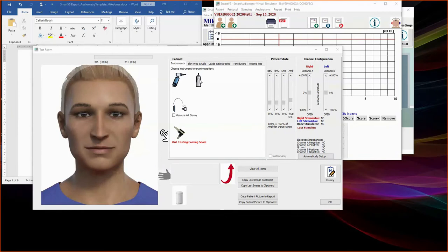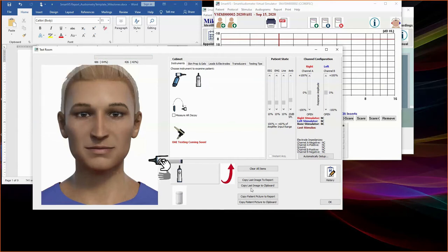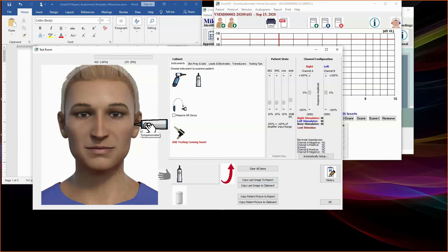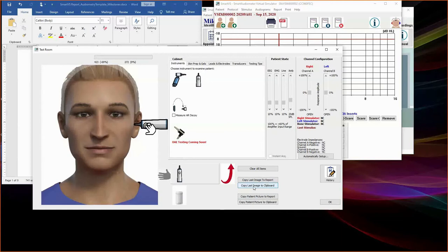Now click on the tympanometer to activate that instrument for testing. Place it over the avatar and into the ear. Press down on the button to generate your tympanometry graph. Once the graph is completed, you can let go and click on copy last image to clipboard and use your paste function to copy it over to your patient report. We repeat the test measurement on the opposite ear. Press with your left mouse click to generate your tympanometry results. Once the graph is completed, you can let go of the mouse click and select copy last image to clipboard to transfer those results to your report. Return the instrument to the cabinet using the red up arrow.